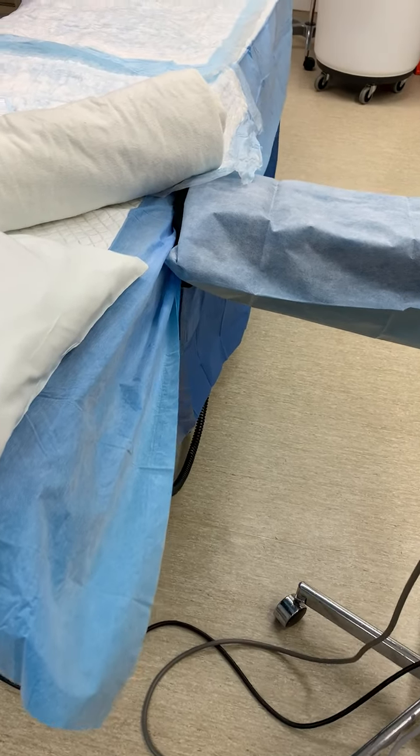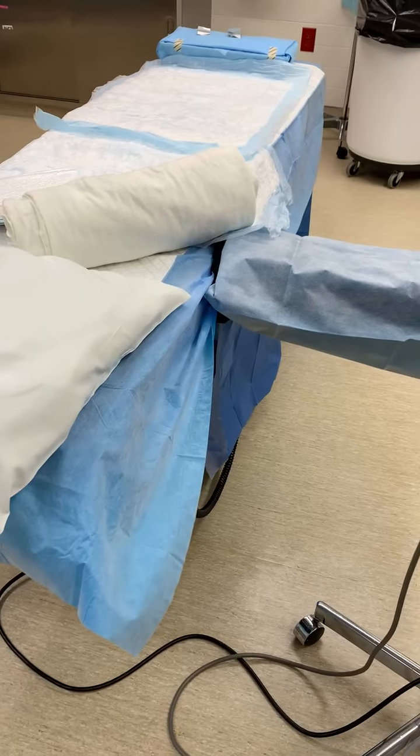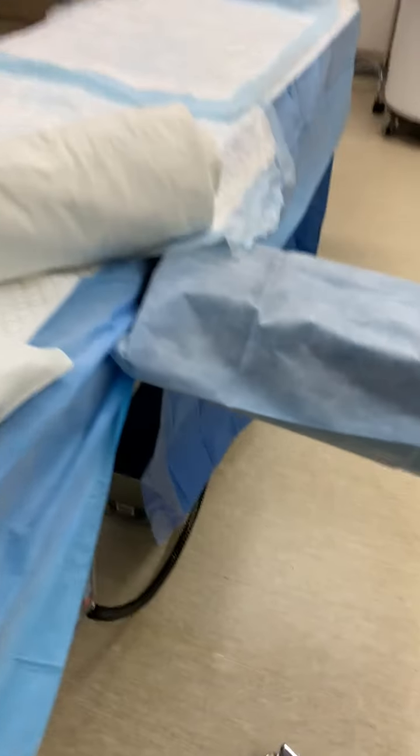Hey everybody, this is a quick little video on moving the c-section bed. Some people are unaware of how to do that in an emergency situation.